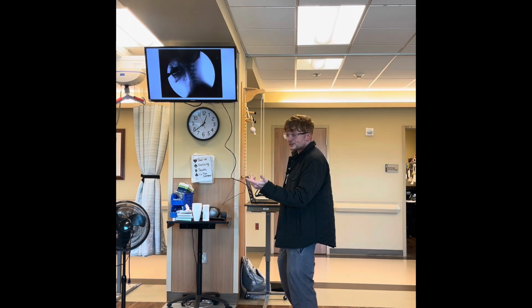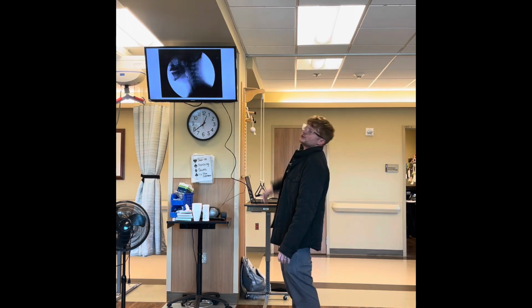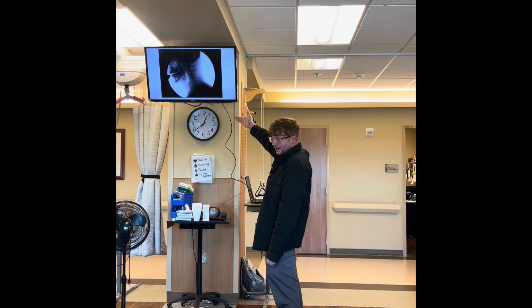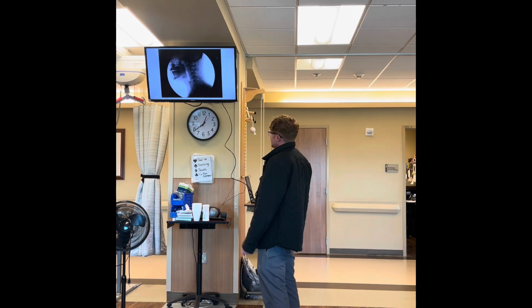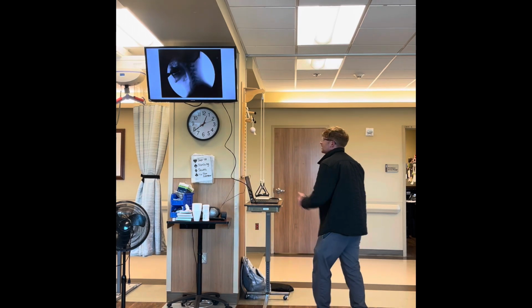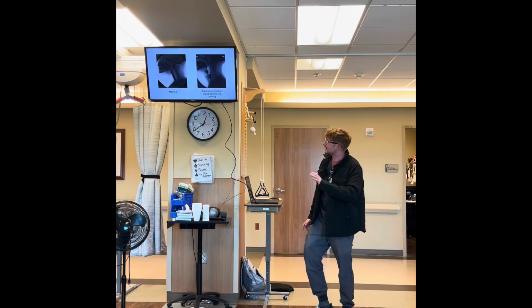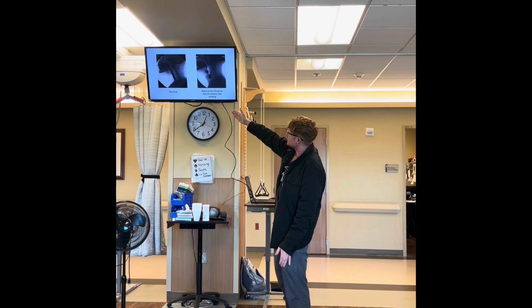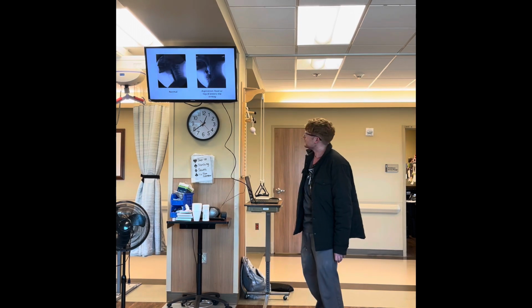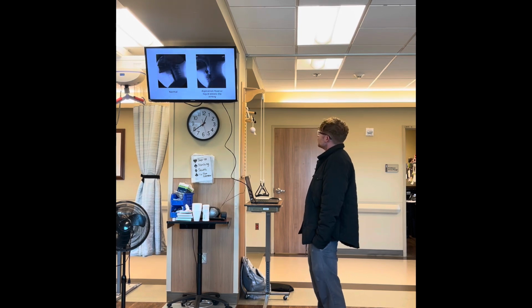So the bone comes up, pulls down the flap, and blocks off your airway. Like you were talking about, Phyllis, with your head back, you are in fact opening the door to that airway. Hopefully your flap closes and you'd be all right, but if your flap's not closing, then you're opening the door and you're just asking for all kinds of possible troubles. That's what we would want to see. Got a couple images here. Normally we have the division there, the white tube, the dark tube. Then we have aspiration. If we saw that, that would not be very good. That would be a bad day at the office, but we do what we can.